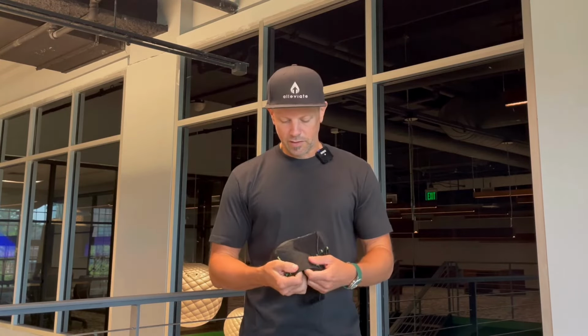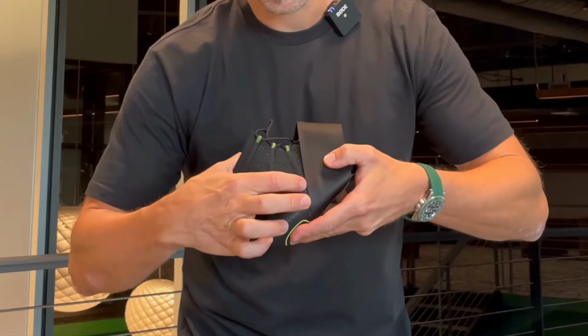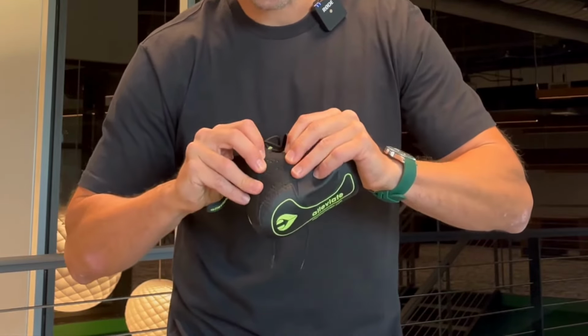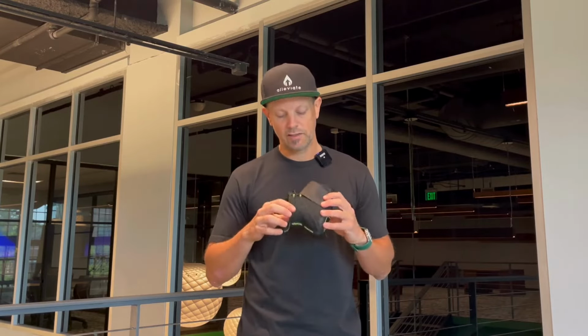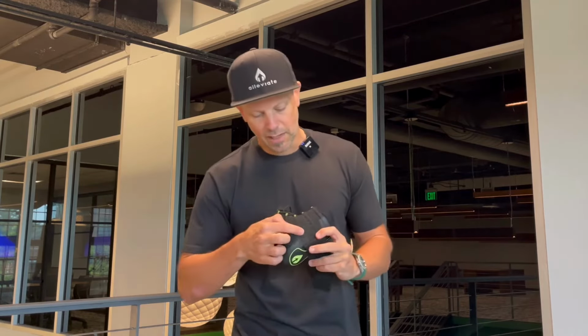You can see when you look at the outside that we have these different zones. This is like a cable, this is a cable, and then you have a zone of stretch in between these cables. You have more stretchy zones to allow the foot to go in and for this to conform to the foot. Because it has a form of elasticity to it, it's going to tighten and cinch up around your foot. And then these cables provide the structure. We placed these cables on the same angles as a low dye tape. These cables basically create a fulcrum to cinch, and if you look at the inside, these cables replicate where the taping would go if you were doing a low dye taping.